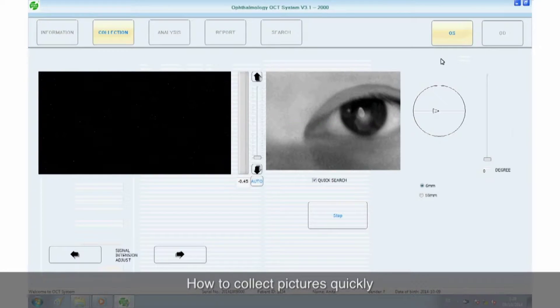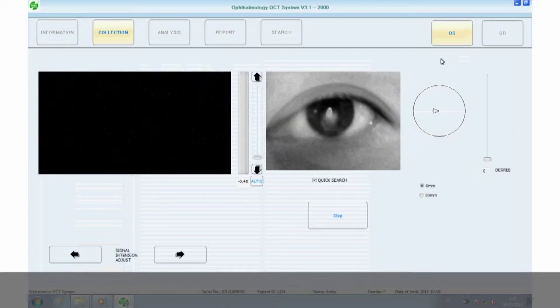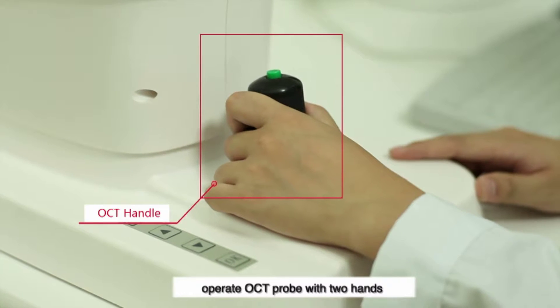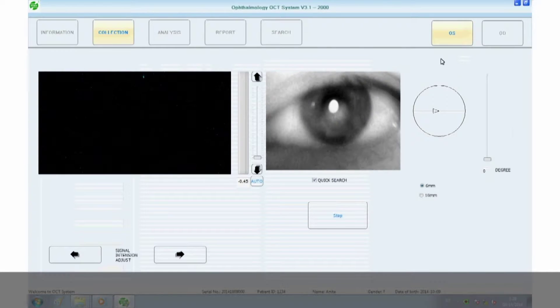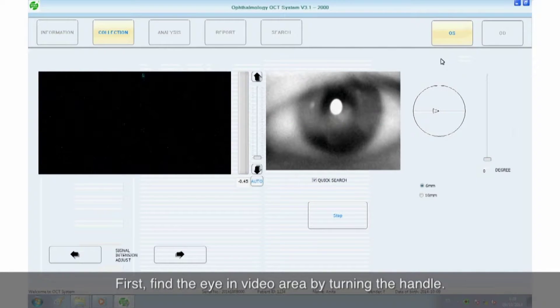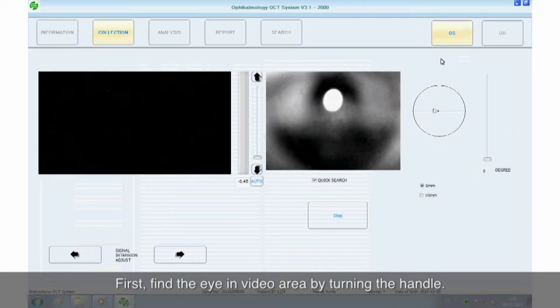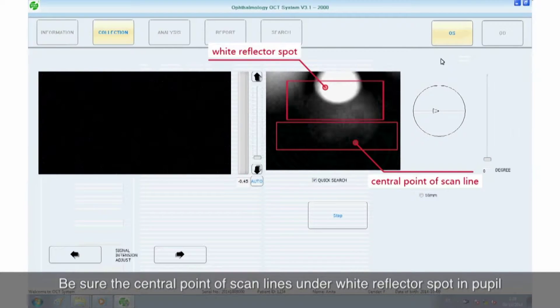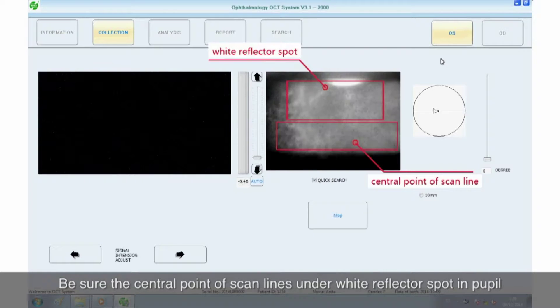How to collect pictures quickly. Step 1: Operate OCT probe with two hands. First, find the eye in video area by turning the handle. Be sure the central point of scan lines under white reflector spot in pupil.